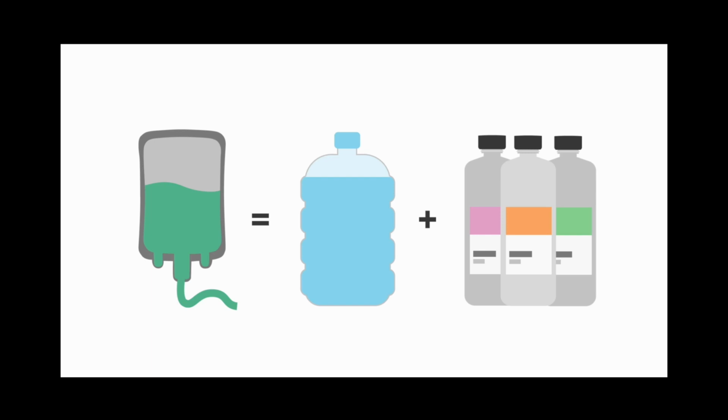The water that comes in the pipeline into the hospital, supplied by the municipality, has many impurities and salt in it. So that cannot be used because those will cause infection or may cause salt deposits in the dialyzer or in the dialysis machine, and that may lead to several complications. So to prevent that, we use the RO water plant, or the reverse osmosis water. So we'll see how the water treatment is done.